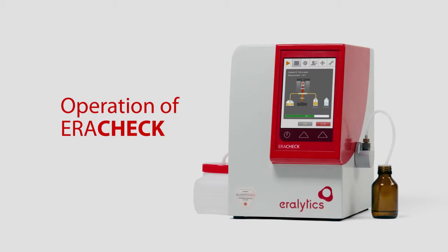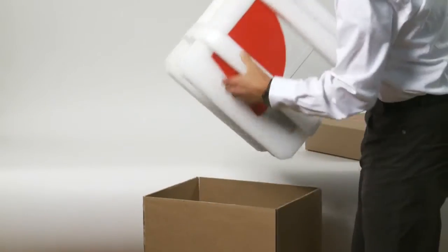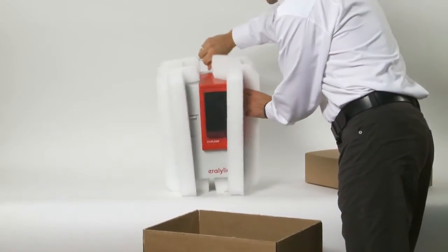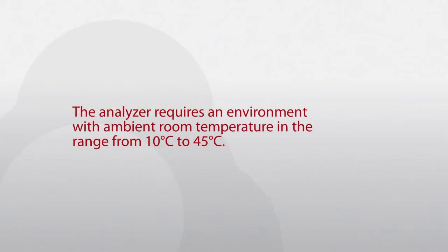After unpacking, place the instrument on a stable benchtop. Make sure that the vent holes of the analyzer are not obstructed. The analyzer requires an environment with ambient room temperature in the range from 10 to 45 degrees Celsius.